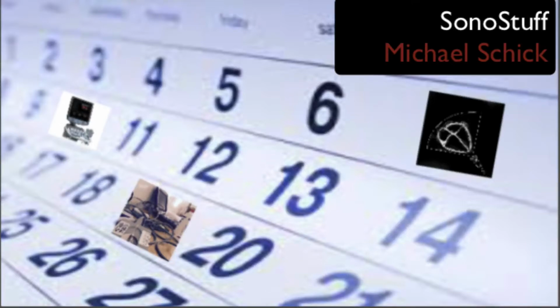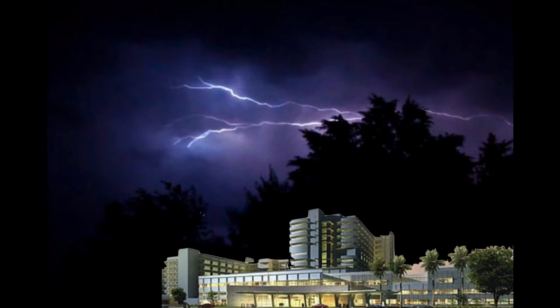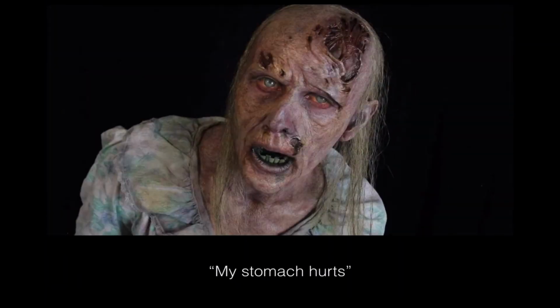I'm Dr. Michael Schick. It is a dark and stormy night at your emergency department, and a patient comes in who has looked better, not looking so great. Patient says, my stomach hurts, meaning they have abdominal pain. Maybe they have back pain too. So what we need is a clinician that knows how to use ultrasound to make a critical diagnosis immediately.